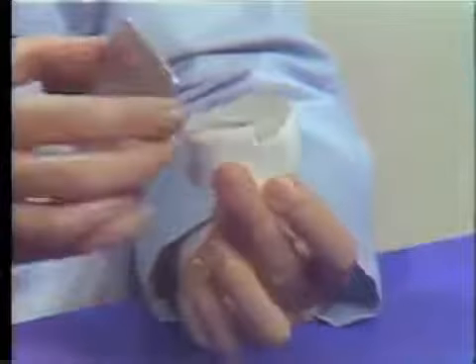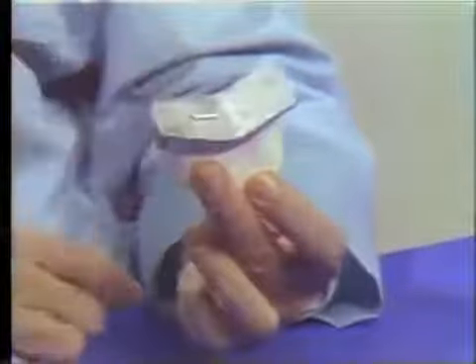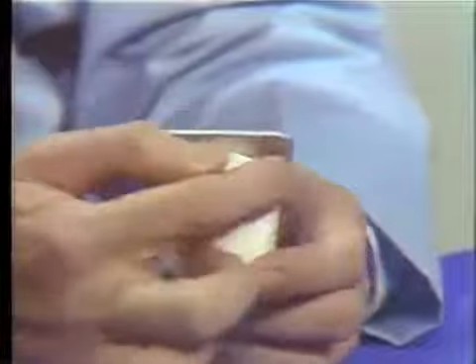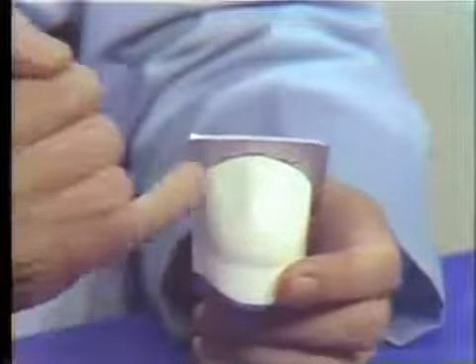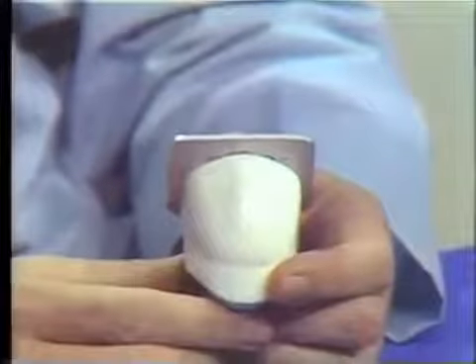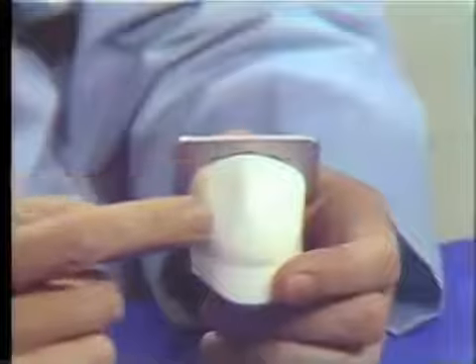It consists, in the case of a bicuspid Pontic, such as you see here, of the backing and the porcelain base. This is an enlarged model, of course. And again, this has to be ground and adapted on the fitting surface here and on the proximals and so on. And then when that's correctly designed, the top is cut down to the exact size, and the occlusal surface is then waxed onto the top here. The boundary between gold and tooth substance here, of course, is predetermined, so that it cannot be modified in any way here, such as you could do with a long pin facing, so that this determines the relationship between the gold protection and the facing here.